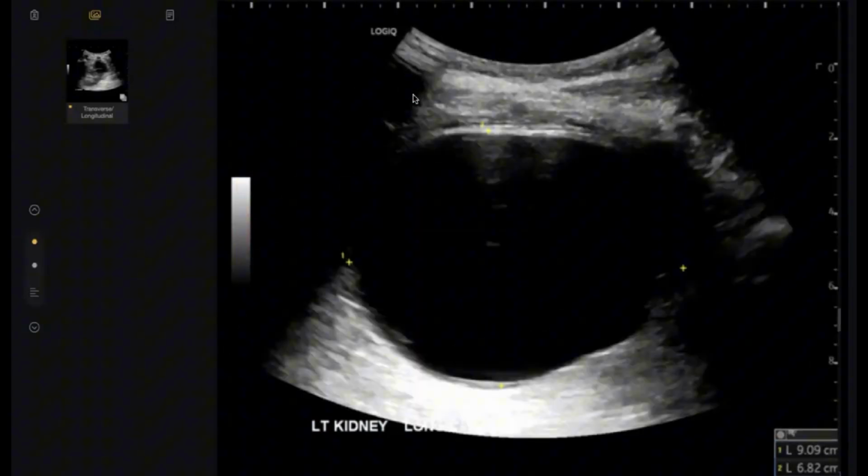Yes, this is the urinary bladder. No, this is, again, the left kidney view in which I can also appreciate a large cystic lesion with wall thickness, having a size of 9 by 6 centimeters with mostly clear fluid. No septations, wall nodularity or wall calcification is noted in this cyst.